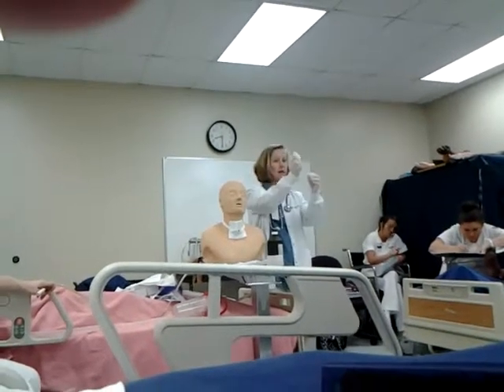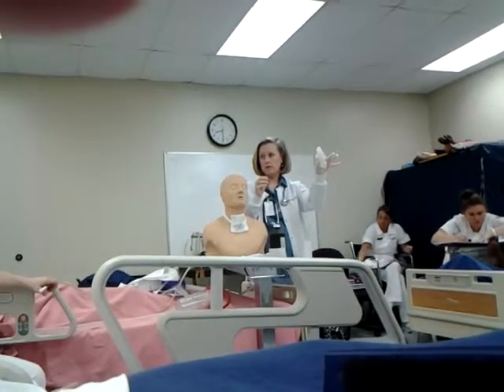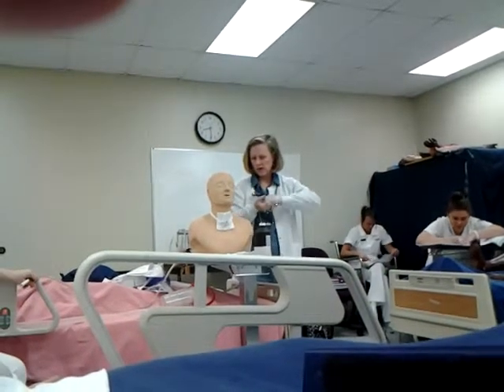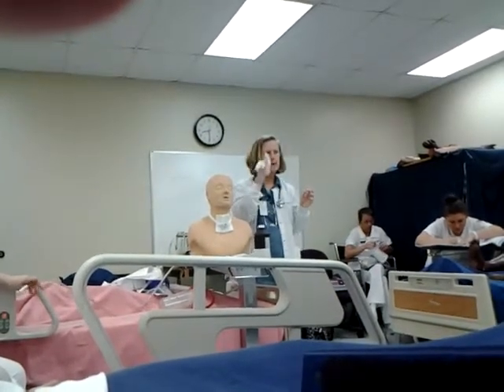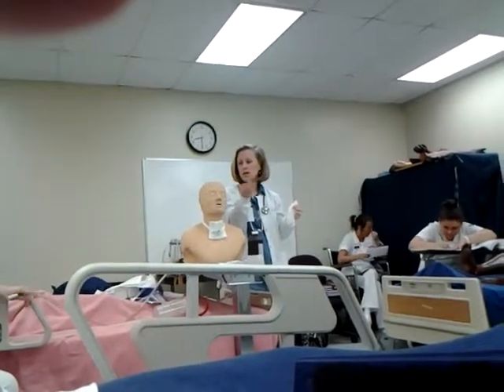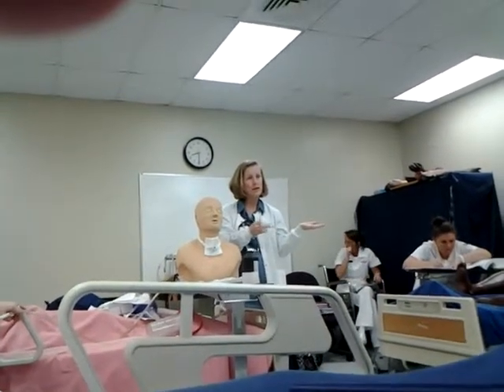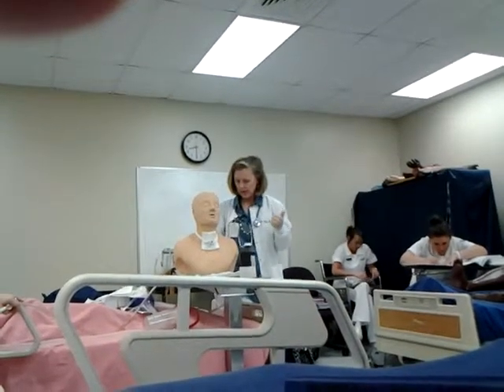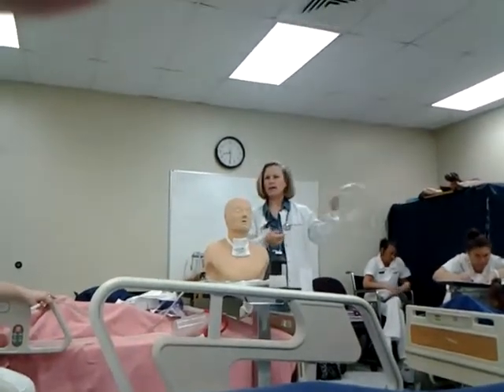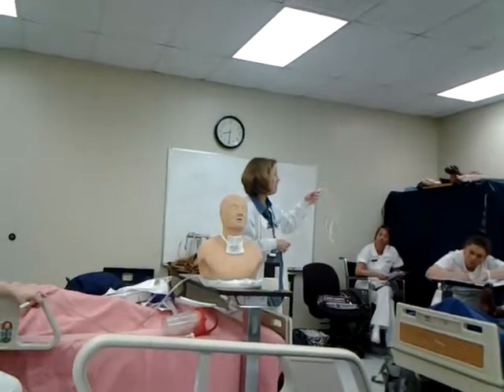Once I have this, then I can pull my glove over this and dispose of it. Some kits that you have, your catheter kit, will only have one glove. That glove's your sterile glove. You would still need to get your clean glove to put on the other hand. When I went to nursing school, and you think about it, you think, well, why do I need a glove on this hand? It's secretions. How's that?